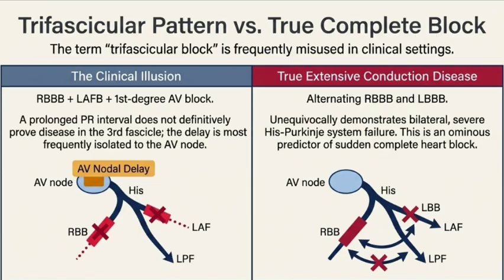Exactly. The crucial distinction there seems to be the word stable. The difference between a new block and an old block dictates everything that happens next. It really is the clinical difference between a cold case file and an active bloody crime scene. Oh, wow. If you find an old bundle branch block by digging up the patient's previous ECGs from 5 years ago and seeing the exact same pattern, they receive standard baseline care. The bridge collapsed 5 years ago, and their heart successfully adapted to the detour.